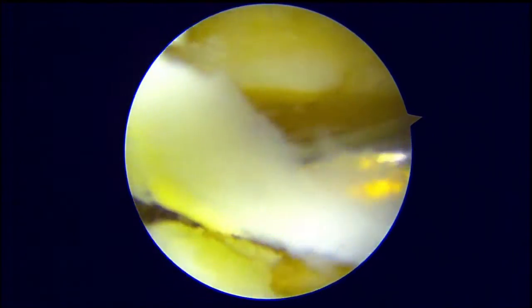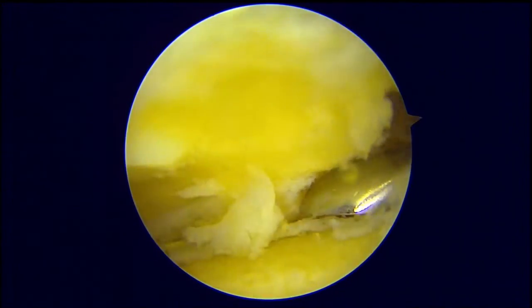Here a curette is being used to remove all the cartilage. Above is the inferior surface of the talus, and below is the superior aspect of the calcaneus. We try to get 2 mm of subchondral bone.